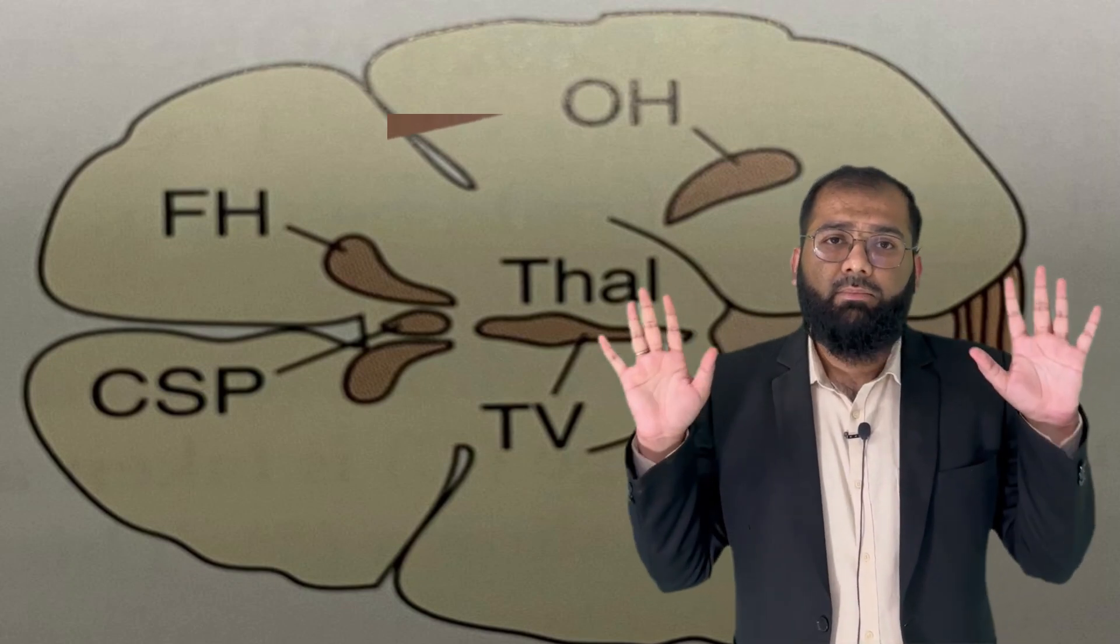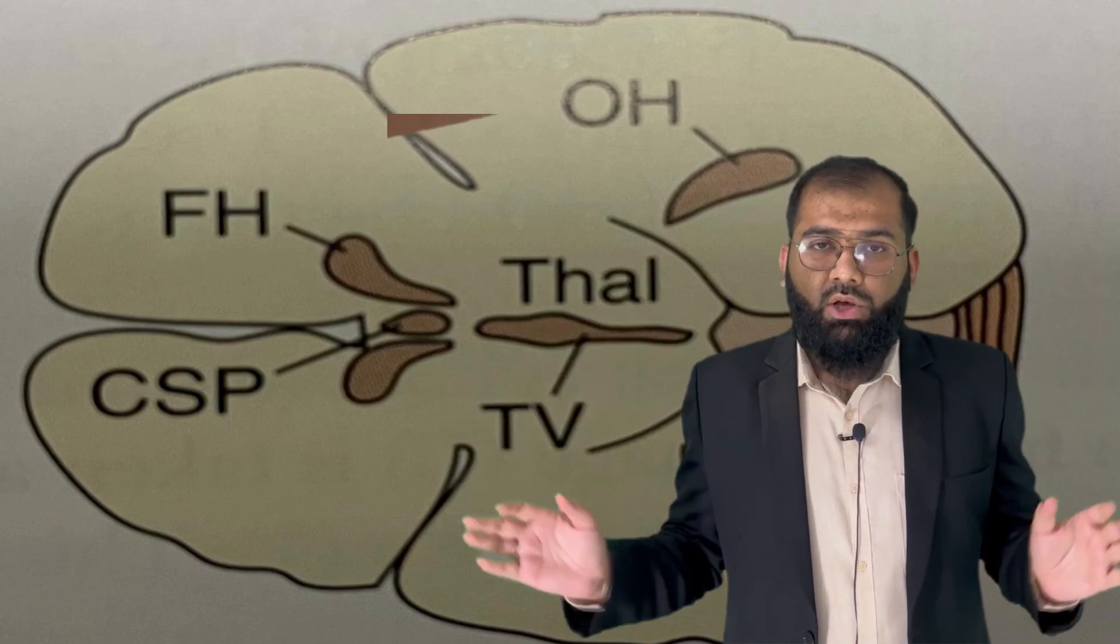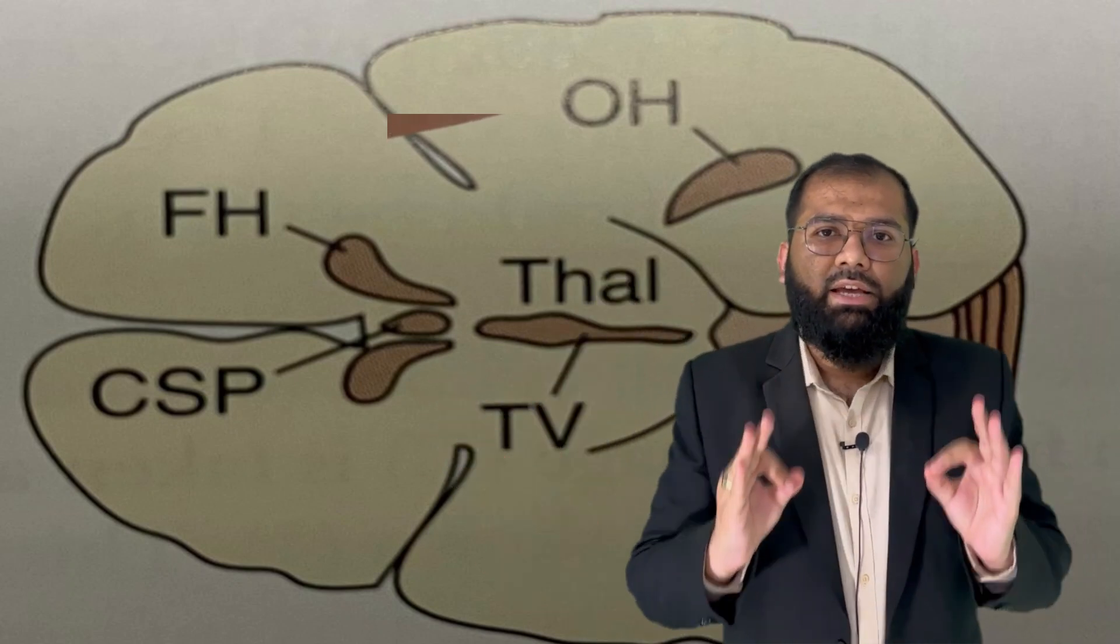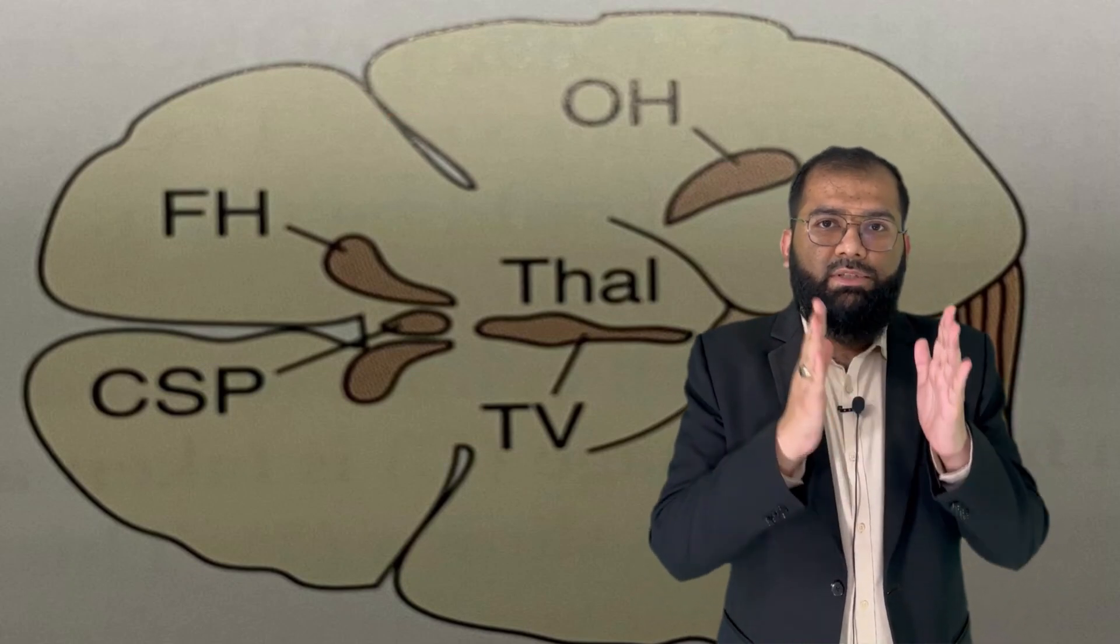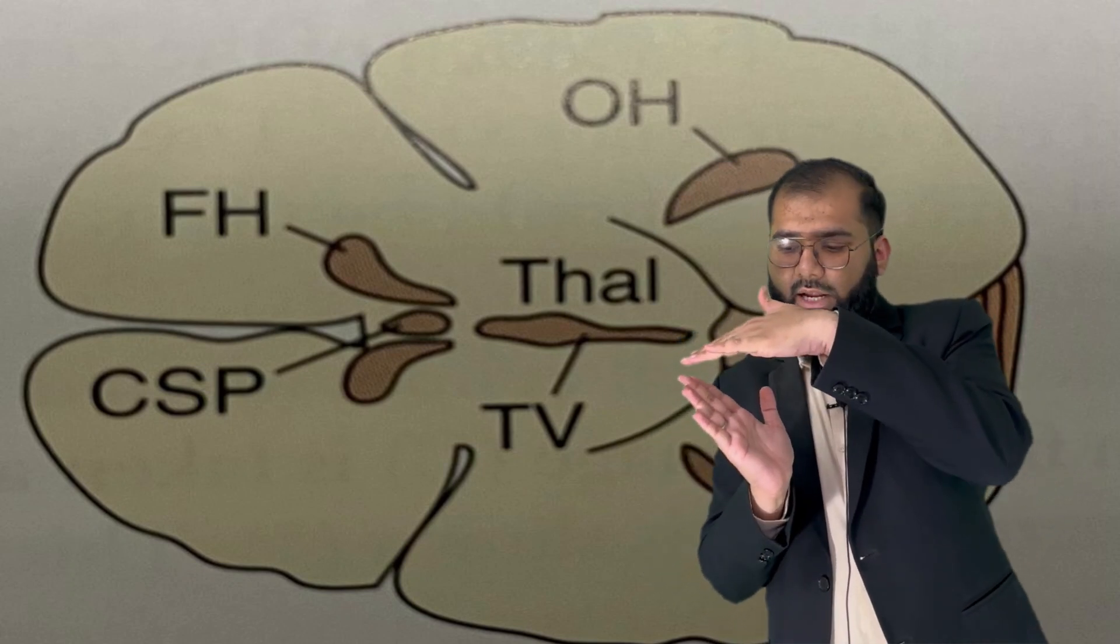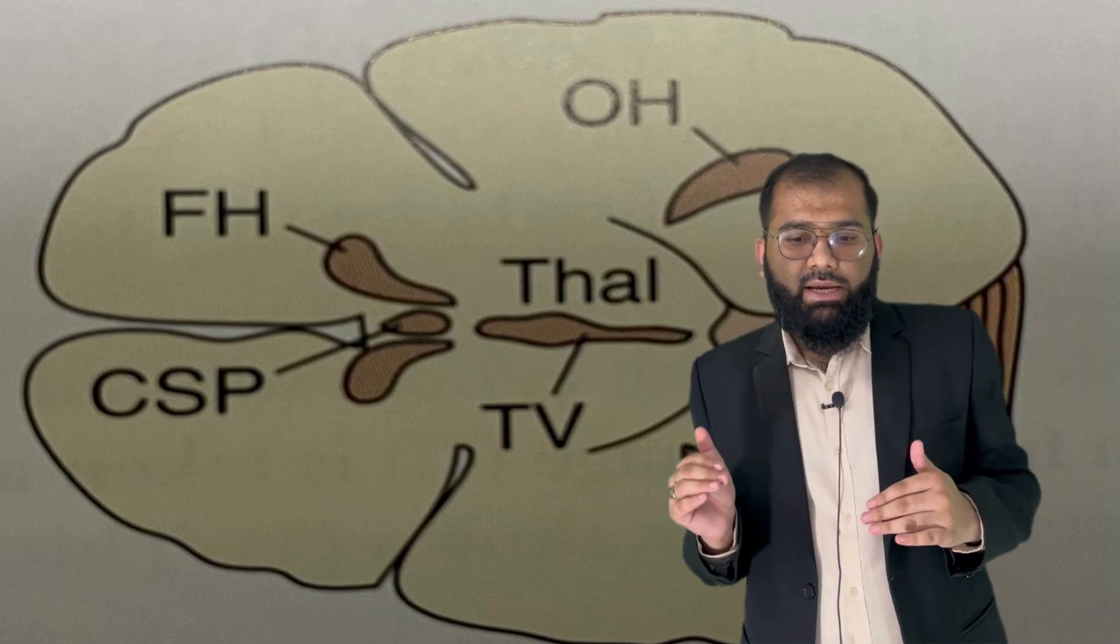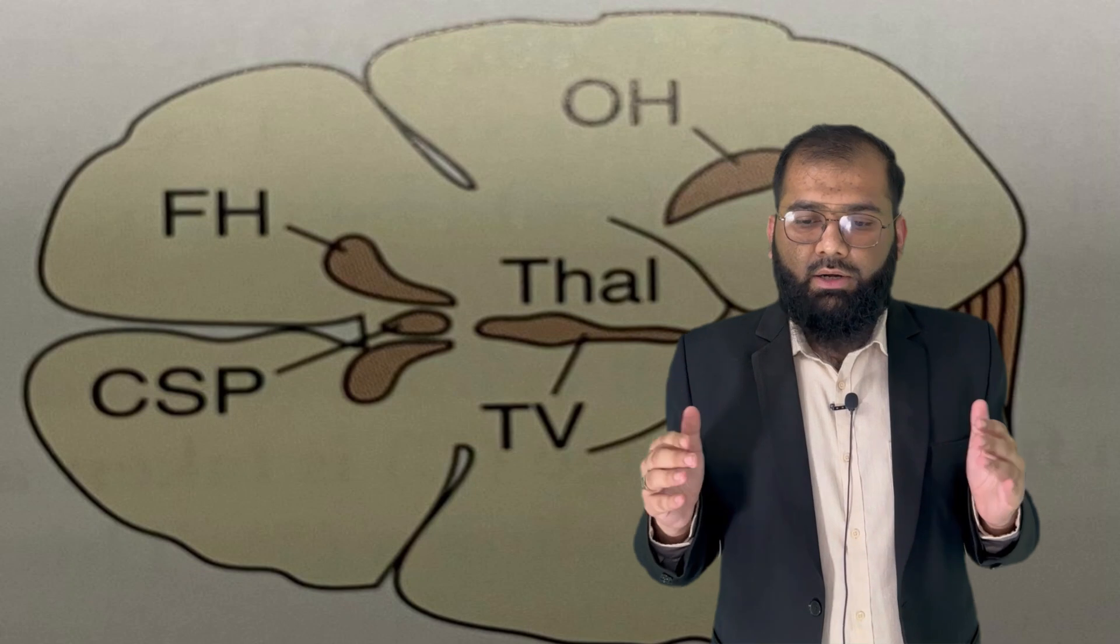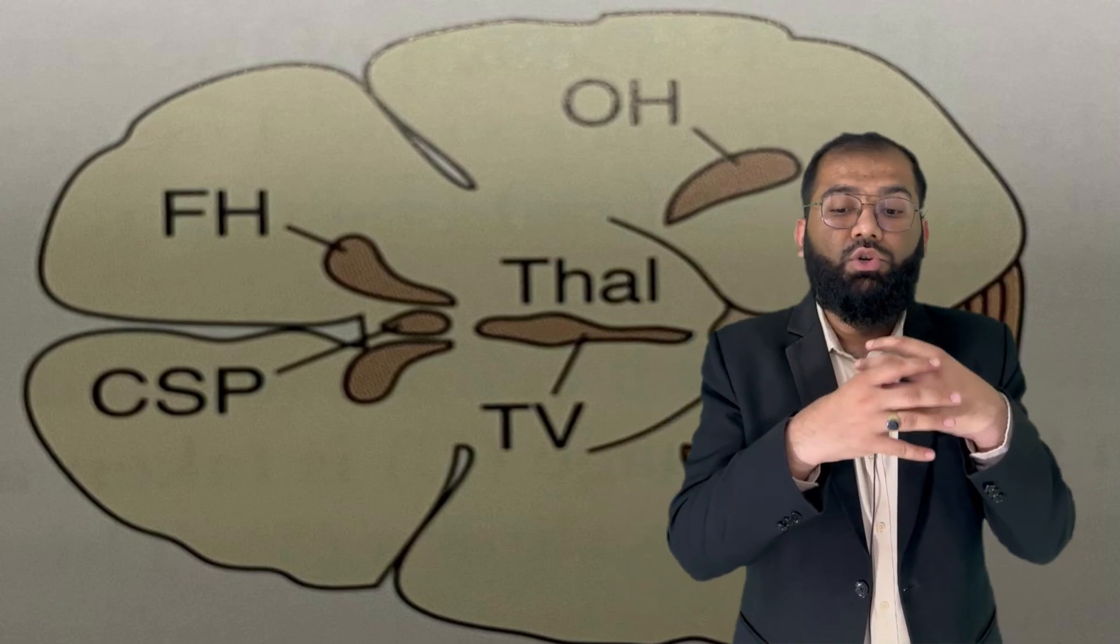Now why is this section important? When you want to take biparietal diameter, you have to achieve this section in which you see the cavum septum pellucidum and the two thalami pointing posteriorly, forming a posterior-pointing arrow towards the occipital side. Very importantly, we don't see much of the cerebellum, cerebellar lobes, or orbits.